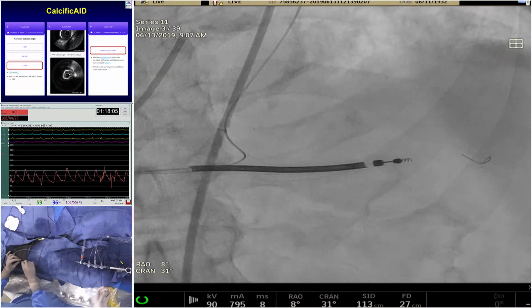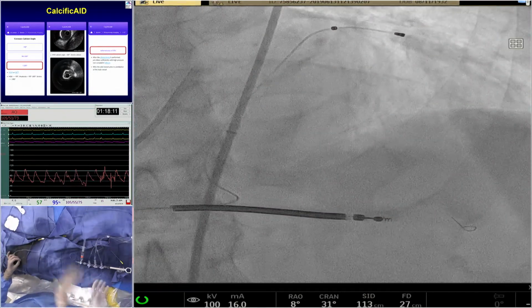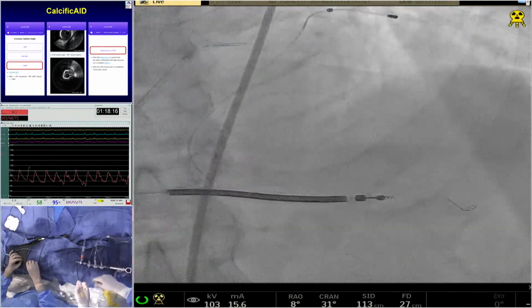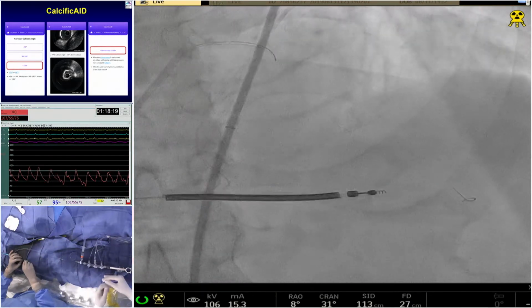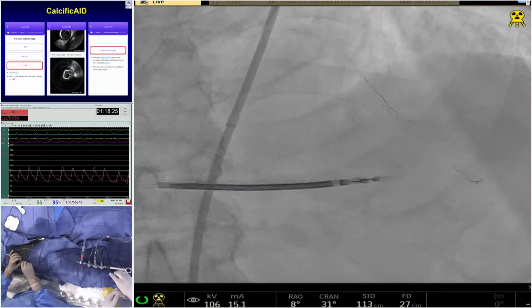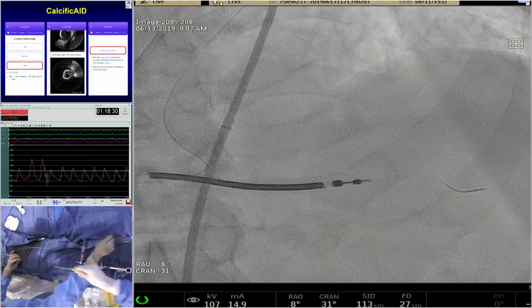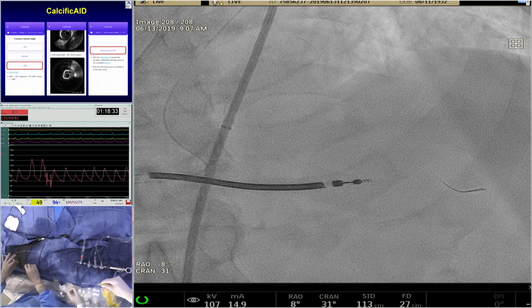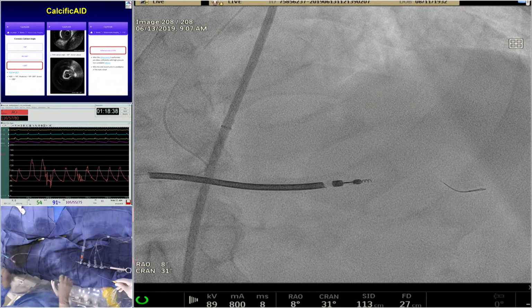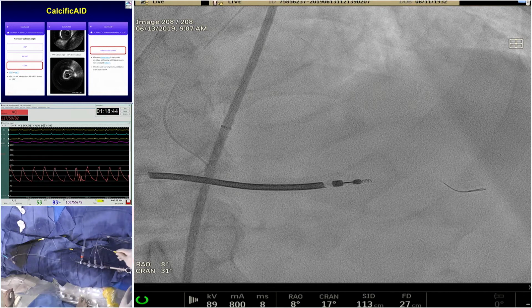Now what is the plan for the circ? Based on the IVUS finding, the IVUS finding was a 4.0. Yves, I know you're going to say just go to the LAD and forget about the circ, or am I wrong? Yves Louvard, Bifurcation Club president from the European Bifurcation Club. Sincerely, I've not seen the lesion very well, so I was just discussing with Alexander that maybe the lesion was more tight in the circumflex. So I think we have to look in detail. Dr. Kinney, can you give us a spider shot now after the rotational atherectomy so we can get a good assessment of that bifurcation lesion of the circ before we tell you what you should do there?